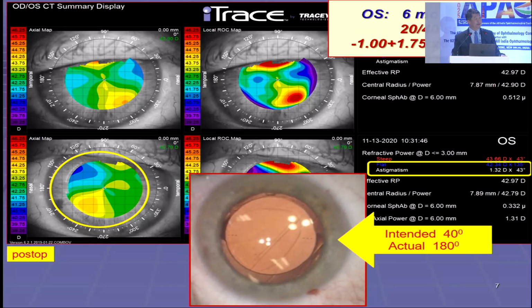All right, now that's one person in the audience. How about my expert faculty? Who would go? It's 6 months out, and she's actually not referred for this. Which IOL was used? I think it's an Alcon T4, single piece. I don't see much phimosis around, and there's not much PCO. So I may still attempt to put in a viscoelastic to separate it there, because there is good coverage all around. If you get one edge, you will be able to open up this bag.